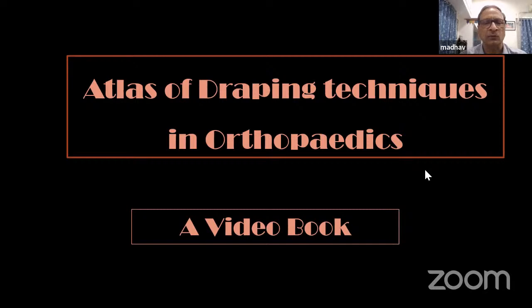Dear all delegates who are attending PTOC and all the residents and the people who are doing their MS or post-graduation, as you all know, surgical site infection for an orthopedic surgeon is a nightmare. And the most important key to a good outcome from an orthopedic surgery is proper draping. Campbell's Operative Orthopedics, the so-called Bible of all the orthopedic surgeons, says that draping should not be left to an untrained assistant or a junior. And if the junior is not properly trained, the surgeon who is operating himself should be doing the draping.